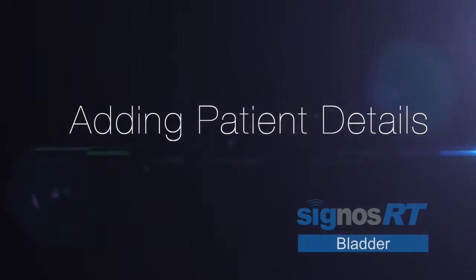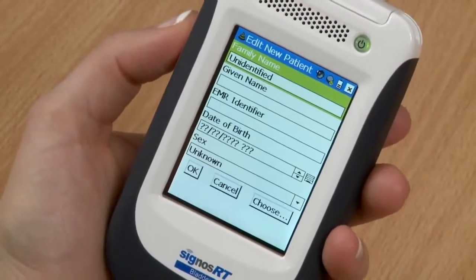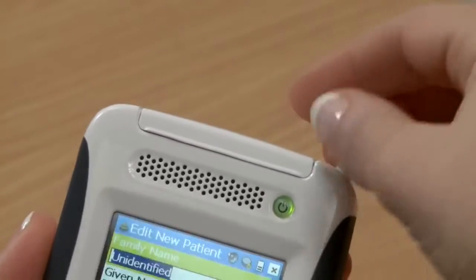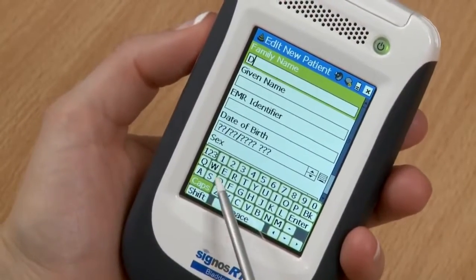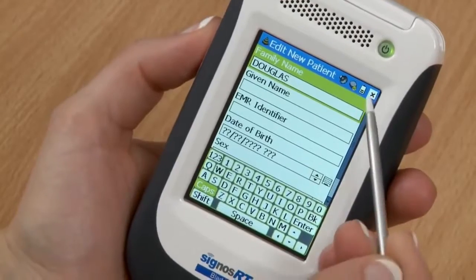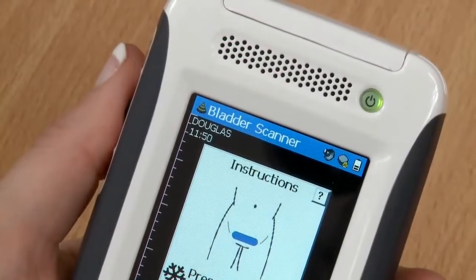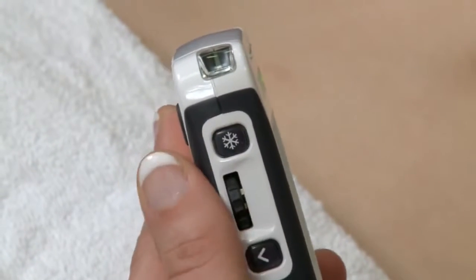If you wish to add the patient's name, select the start plus patient icon before you begin scanning, which will allow you to add the patient's details using the keyboard, which appears when you touch the family name icon. Type in the name, close by selecting the X and save the changes. The name is displayed in the top left corner of the screen.